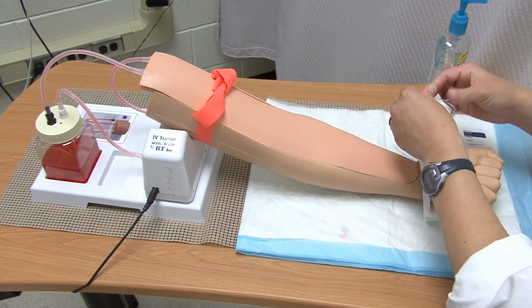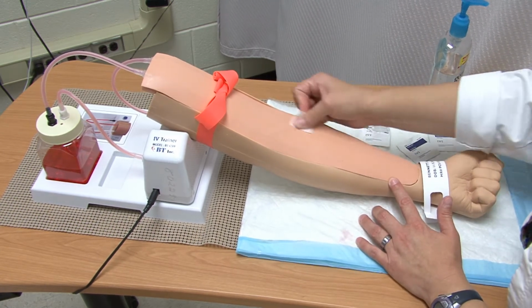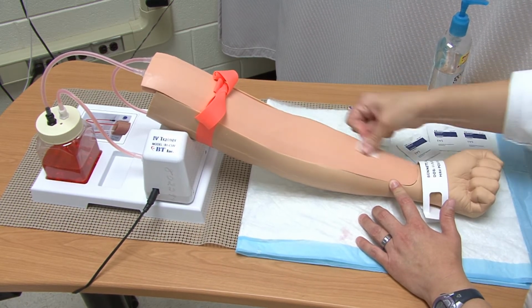The next thing I'm going to do is take an alcohol swab and put it on the vein. I'm not cleaning it for actual insertion, so I'm just helping it illuminate the vein. Usually it helps them show and you can see them a little bit better.